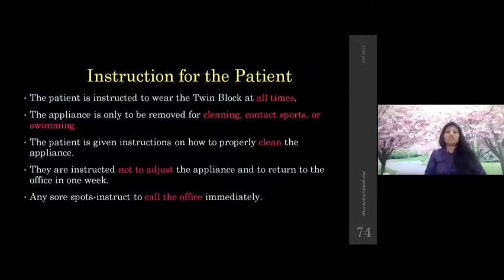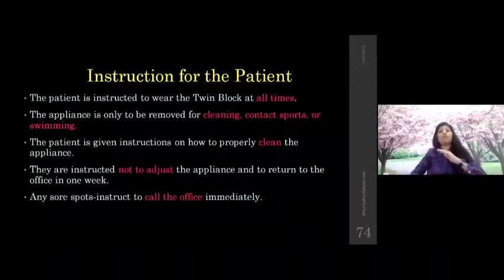Then instructions for the patient. First and foremost instruction which you give is wearing duration. On the first day, the patient is asked to wear the twin block appliance for 7 hours. On the second day, it will be double that. On the third day, you should wear it for 24 hours together. And from day 3 to day 7, he's supposed to wear the appliance for 24 hours.